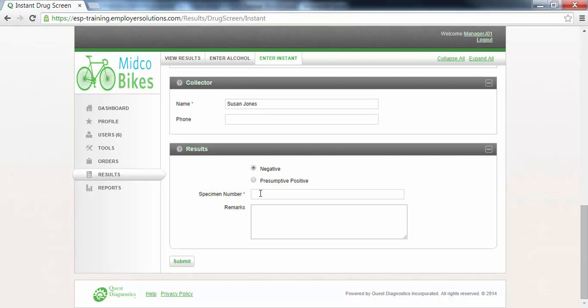The specimen number field is where you will enter the unique identification number of the custody and control form that was used. In this example we will enter the numbers two through eight. Any remarks concerning this test can be entered in the remarks box.